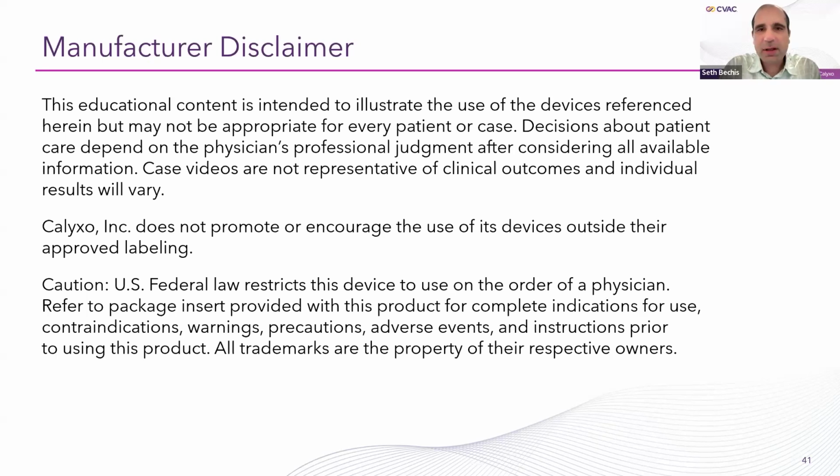So I always joke with our residents when I'm teaching, I try to do it the same way every time. I typically will place a wire and then shoot a retrograde pyelogram to get a sense of the ureteral caliber. And sometimes if a ureter is particularly narrow or tight, you can appreciate that feedback. I do serial dilation. So I'll use a 10 French and then a 12 French inner obturator from the sheath. And if that goes smoothly, then I'll put in the 12-14 French ureteral access sheath.